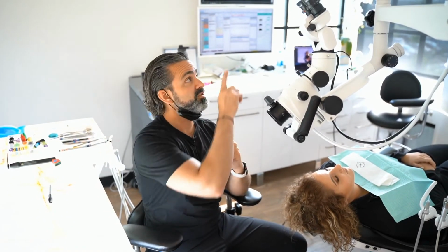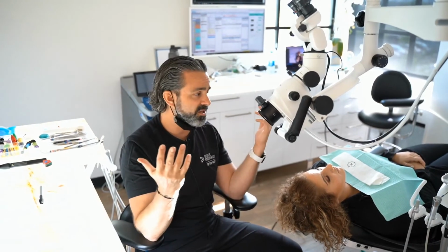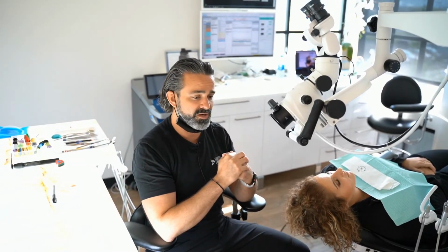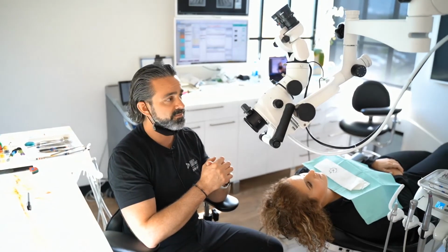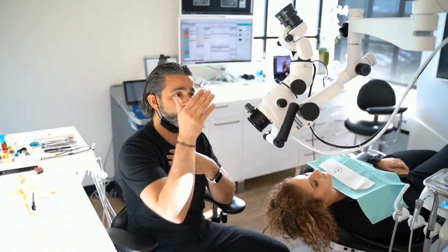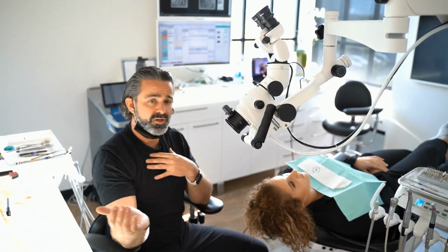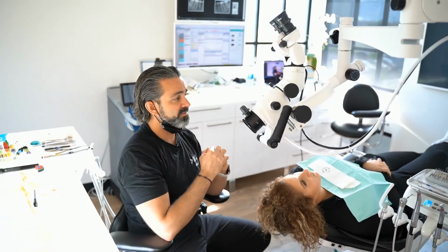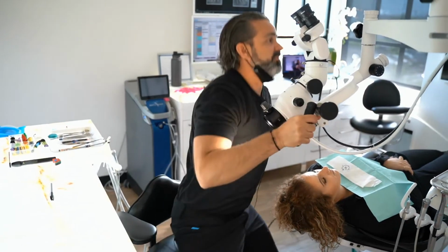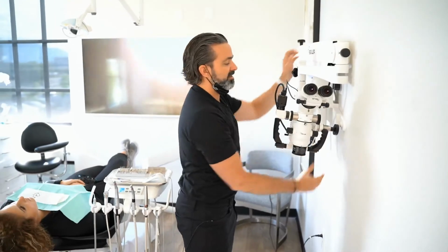That may influence whether you mount floor, ceiling or wall. The other thing is left- and right-handed doctors. If you're going to share a room, that's something you'll want to consider. If you own your own practice and have your own room, then by golly, put it where it makes sense. My recommendation would be right where it is. People thought it would interfere with patient flow. I can enter my room from both sides, but where I have my guest chair sitting, this microscope tucks up on this wall. I wanted it to fit the look and feel of my office, so that was a big selling point.